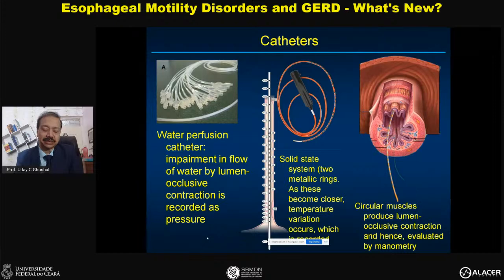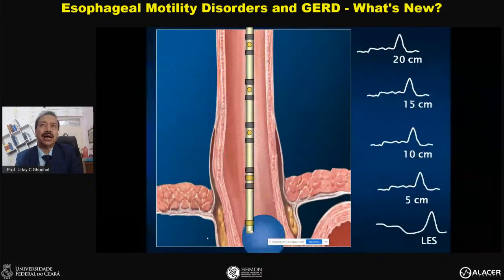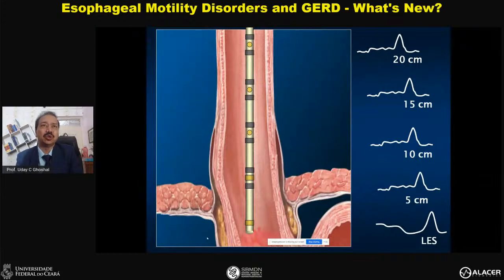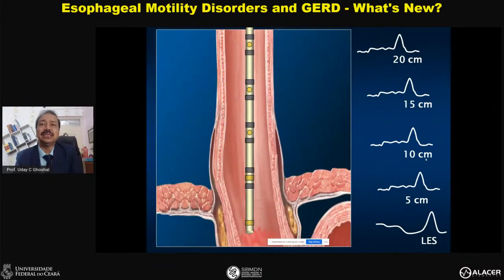muscle activity as well. Now let us say this is the esophagus, and you can see those round yellow circles represent the manometry ports. Now when a fellow swallows, what happens is that the bolus goes through the esophagus. Obviously, the esophagus contracts and relaxes in different locations. So the location above, the esophagus is contracting, but at the same time, the location below, it is relaxing, and that leads to propulsive activity, which propels the bolus into the stomach. And this propulsive activity is recorded by the manometry system.